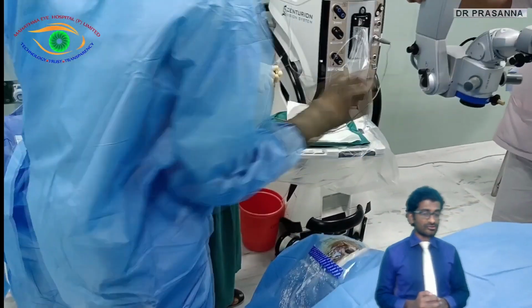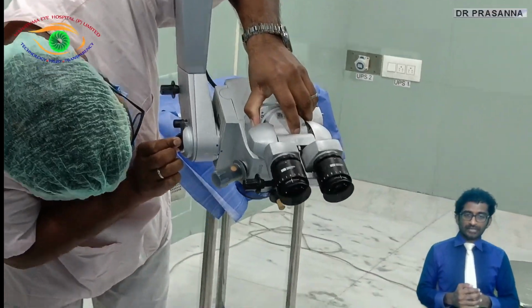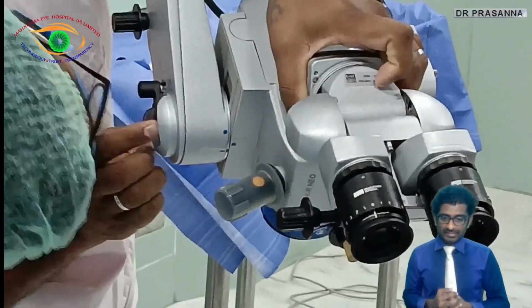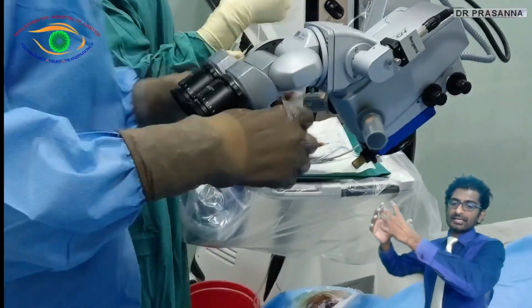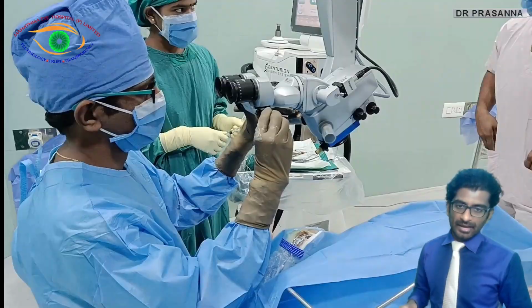What do you do after you finish your cataract, especially when you are combining it along with MIGS? Just pass your microscope, and you can see that the microscope is now being tilted 40 degrees towards me, that is the operating surgeon, and then it is sent back. And once it is sent back, what you need to do is just make sure you incline the eyepiece back to whichever is more comfortable for you.